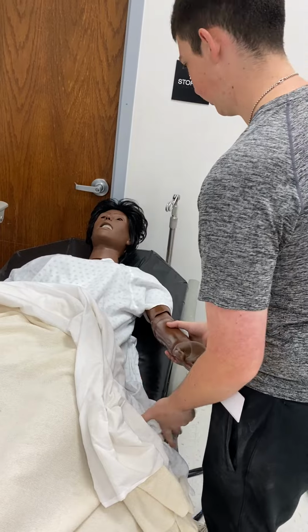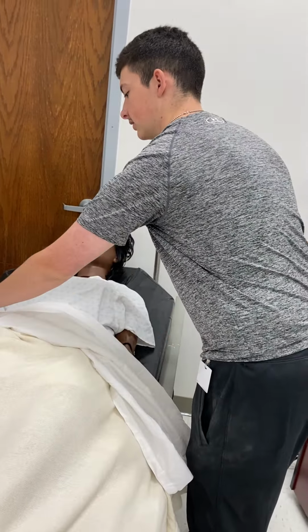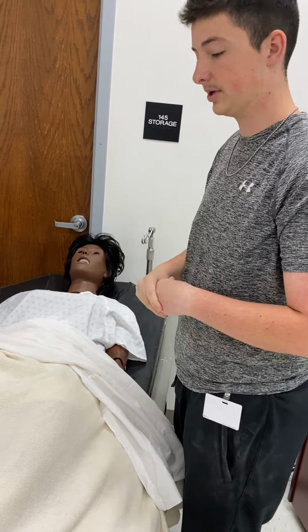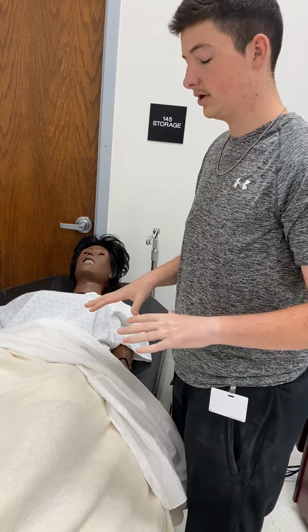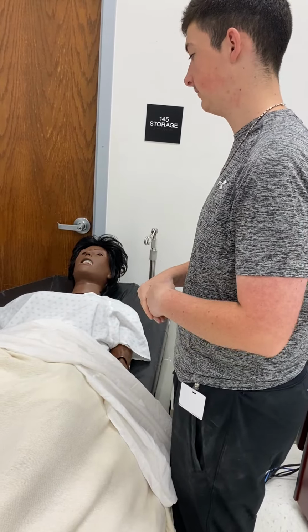Okay, perfect. Good morning, Ms. Jones. Today we'll be taking care of your dressing, your sterile dressing. I'll be changing it today, and before we get started with any of this, I just want to let you know, do not touch any of my sterile fluid or your dressing to minimize the chance of infection.